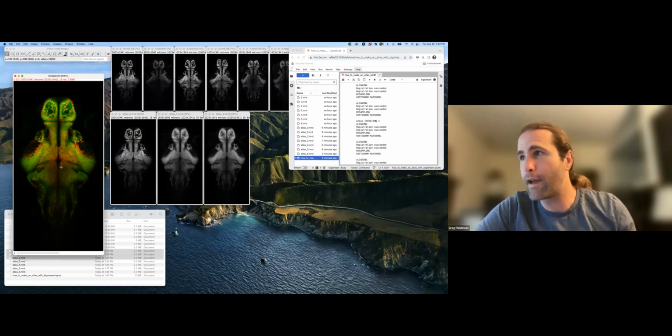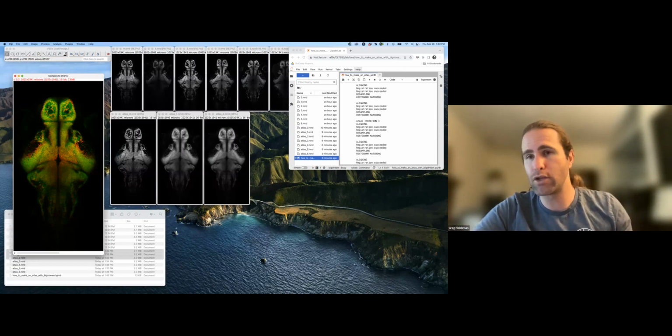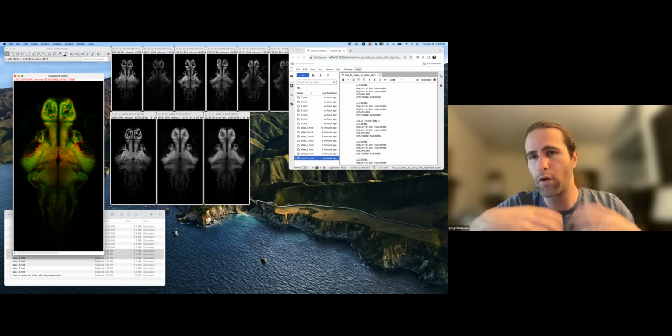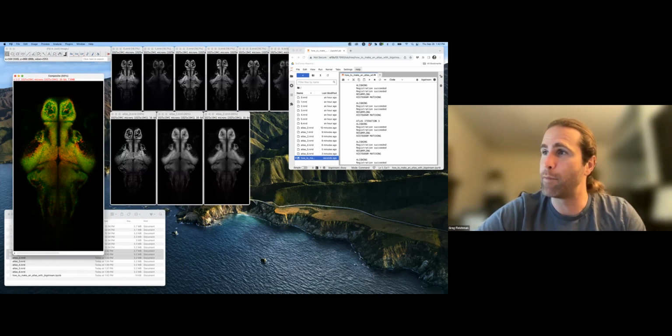All of these things have changed because these locations in green of the anatomy are more equidistant from all subjects in the population than the original location of those same anatomical structures in your single subject. So we have moved the shape of the brain to something that is more representative of the shape of all brains in your population than just the shape of one specific individual's brain.